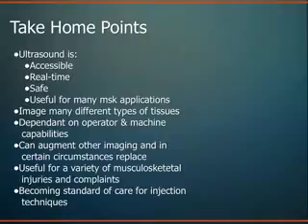So, take-home points for MSK ultrasound. There are a lot of benefits for this modality, especially in the world of MSK and sports medicine: real-time accessibility, very safe, and a lot of applications for MSK imaging. You can image all kinds of different tissues, and it's important to keep in mind, as you're imaging those tissues and looking for pathology, that you have to realize not only your personal limitations but also the limitations of the ultrasound machine, as you get more and more training and more comfortable with the modality.